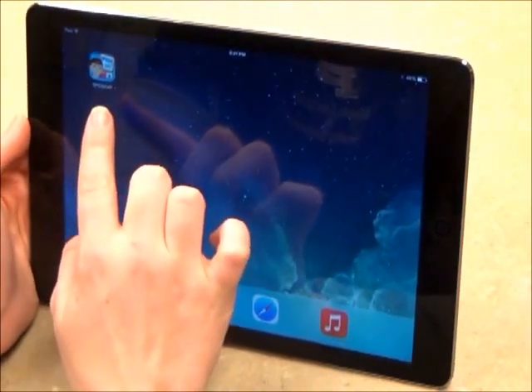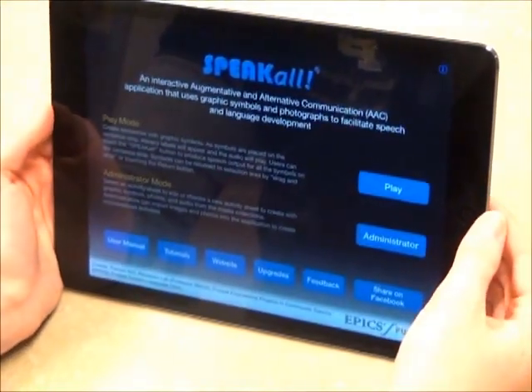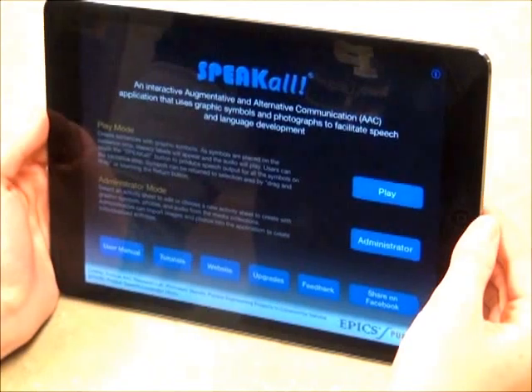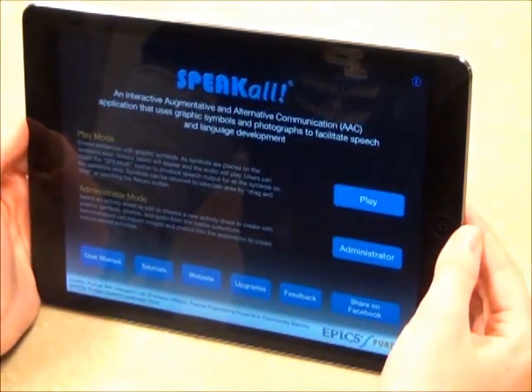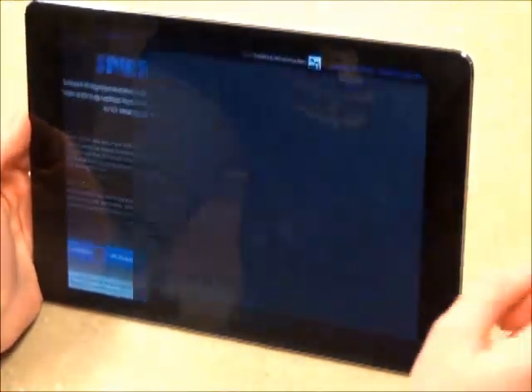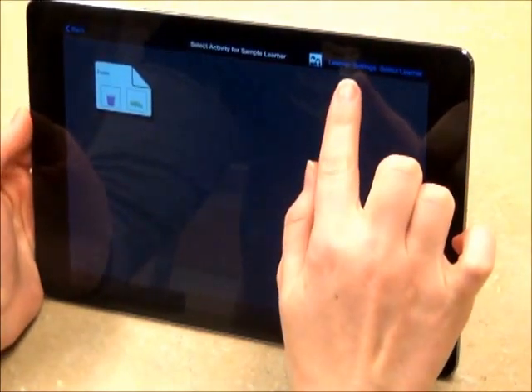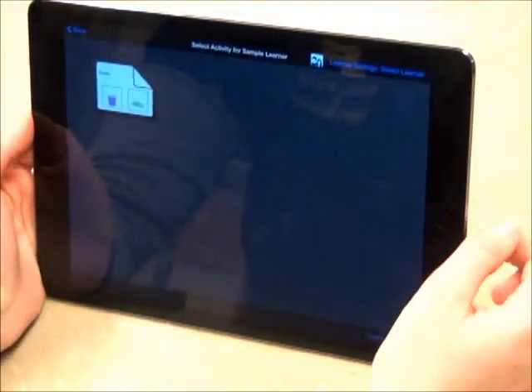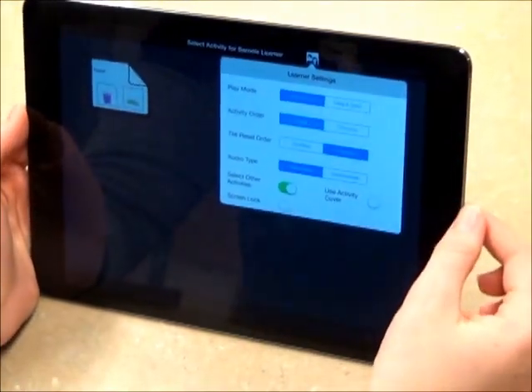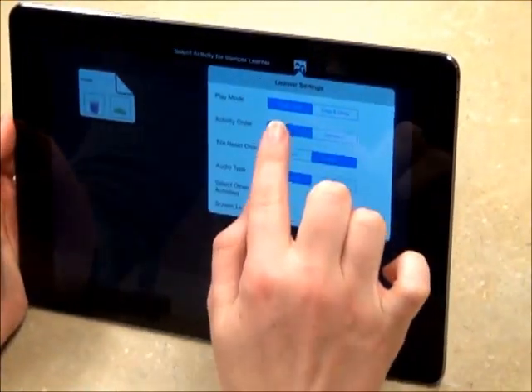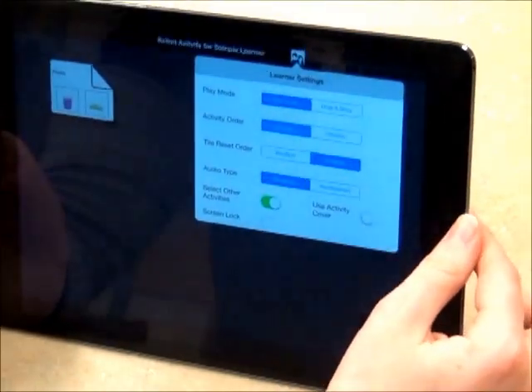This is the Speak All app. Tap to open it. First, I will show you how to customize learner settings for individual learner profiles. Tap Play. The learner settings may be accessed here and then also in administrator mode. The first learner setting is play mode.